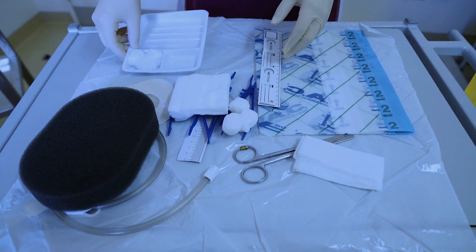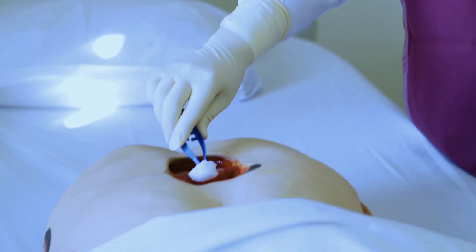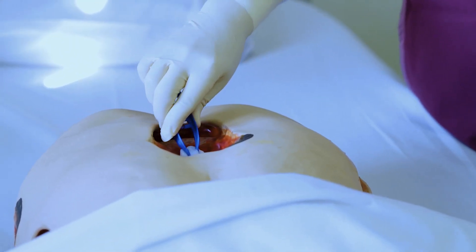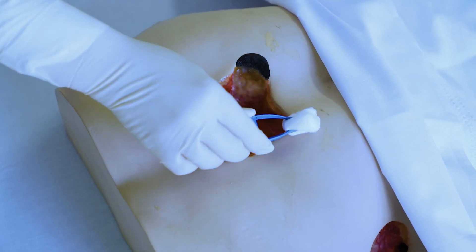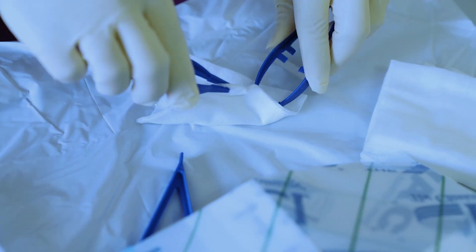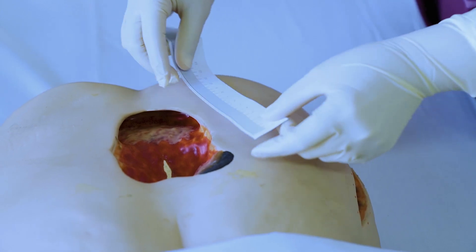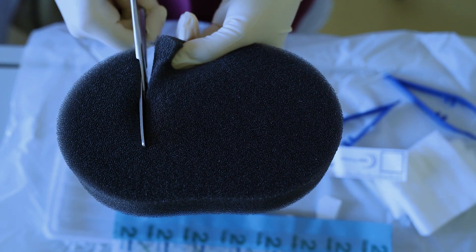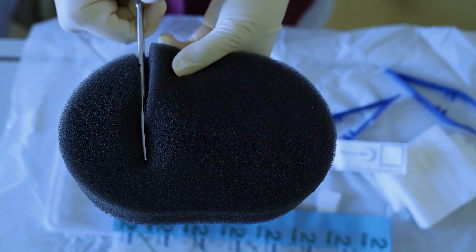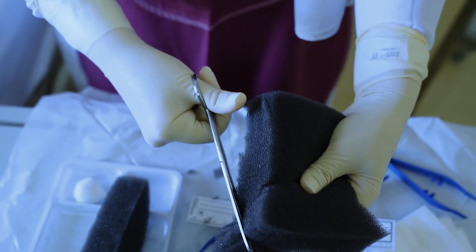Wear sterile gloves and arrange the dressing table. Clean the wound with normal saline, or irrigate if the wound is deep. Clean the area around the skin with normal saline. Dry the surrounding skin with sterile gauze. Measure the wound size.